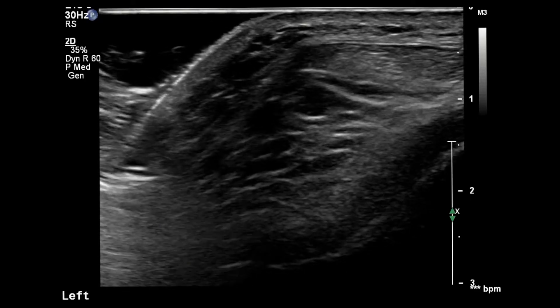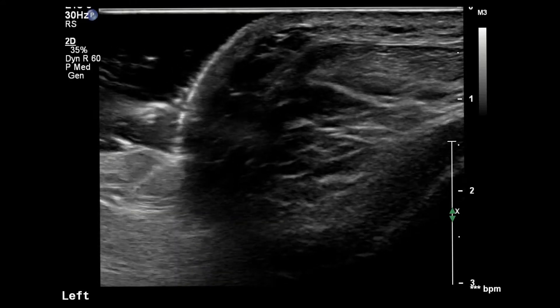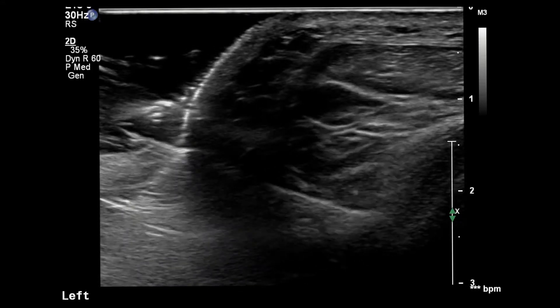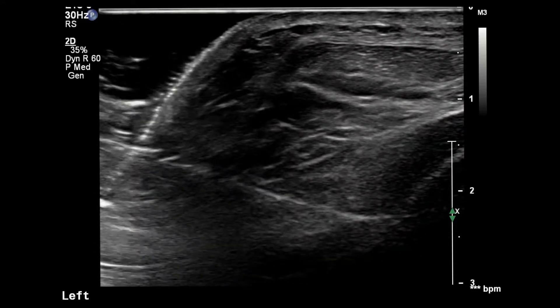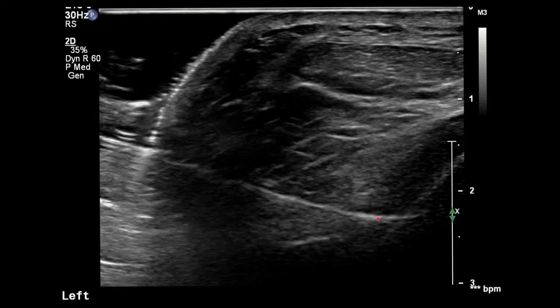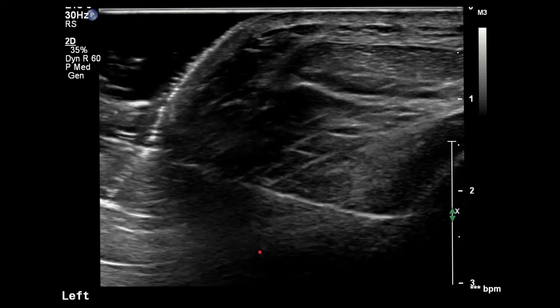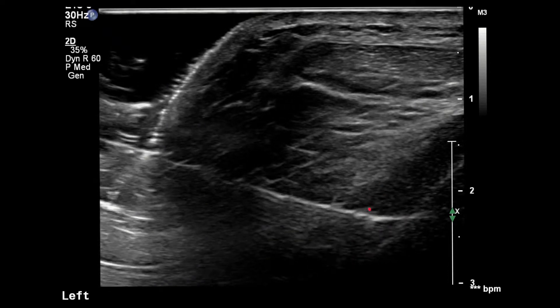This is a follow-up video to my original video on the novel approach to knee injections. In this one I'm injecting visco supplement with a 21-gauge needle. You can see that the needle tip is here along the cartilage interface, and the fluid is flowing between the adipose tissue and the cartilage itself.